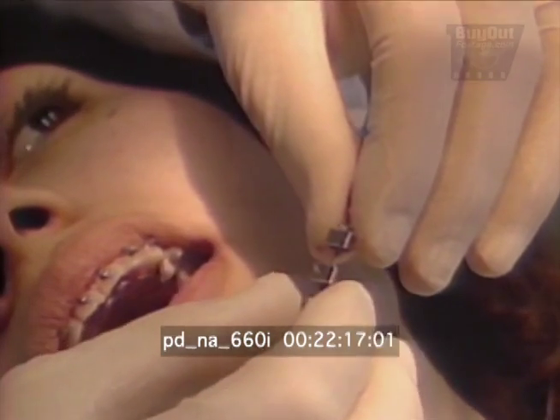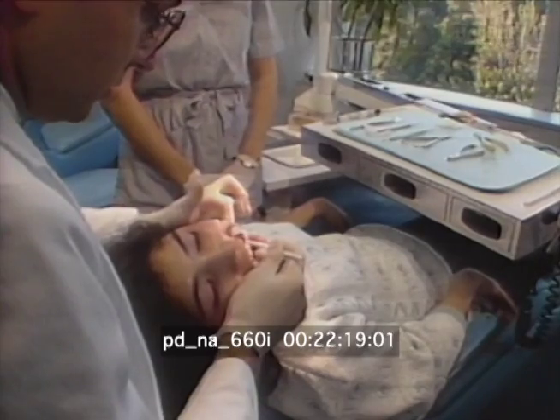It definitely will reduce treatment time — anywhere from a couple of months to a year or two. The magnets are about $200 more than headgear or elastic bands.